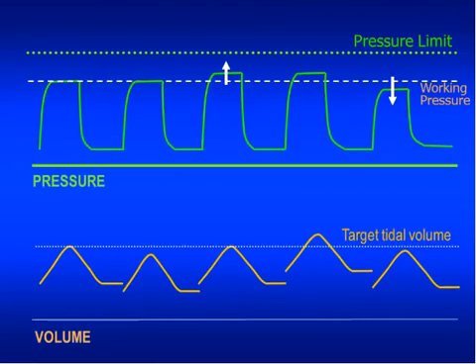For those who may not be totally familiar with it, let me explain it. This is very interesting. The slide, somehow the lines migrated here. They used to be nicely joined. Something happened in translation, so use your imagination and line them up here. Anyway, in the upper panel you can see in green the pressure limit, and you can see the pressure waveform.